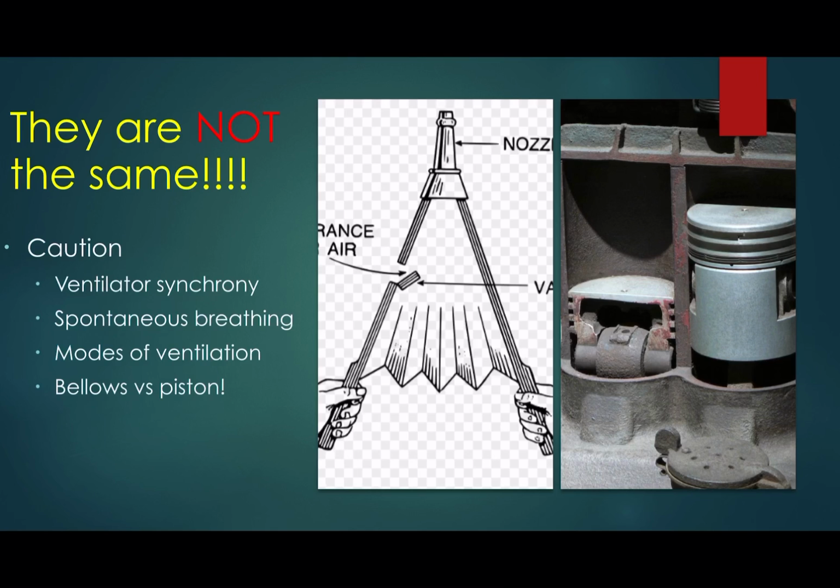Generally speaking, in anaesthesia, we paralyse our patients or have them under a deep plane of anaesthesia, and so we don't often have them spontaneously breathing. As such, a lot of the older anaesthetic machines just have a pressure control and a volume control mode.